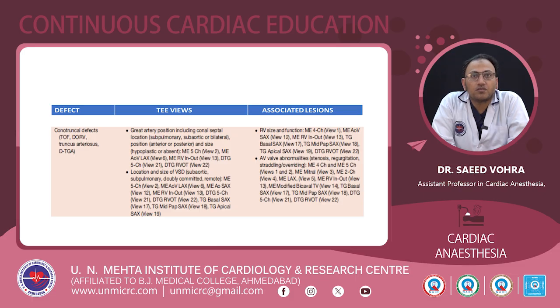For the location and size of the VSD, whether it is subaortic, subpulmonary, doubly committed, or remote, the mid-esophageal five-chamber view can be used, along with the mid-esophageal aortic valve long axis view, mid-esophageal short axis view, and mid-esophageal RV inflow view, and the deep transgastric five-chamber view. The transgastric mid-papillary short axis view and transgastric apical short axis view are also useful.